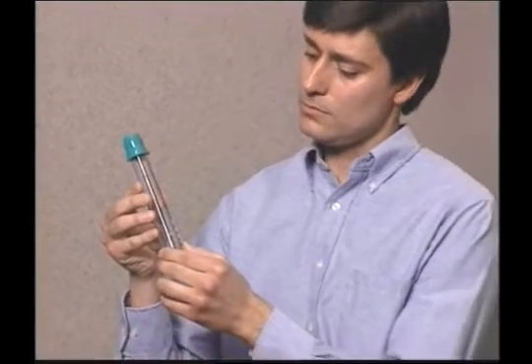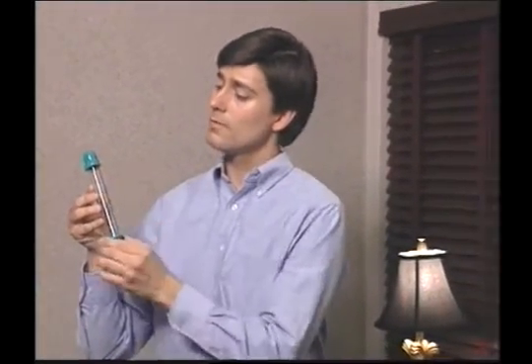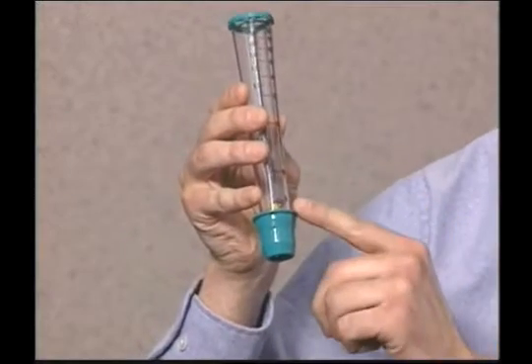Before beginning to take readings, the patient should make sure the yellow indicator has been reset, resting within the diamond near the mouthpiece. If it isn't, the patient should gently shake the PFM in this manner until the yellow indicator is positioned in the reset diamond. The noise from inside the TruZone PFM is normal and has no effect on the readings. Now, the patient is ready to measure their peak expiratory flow.